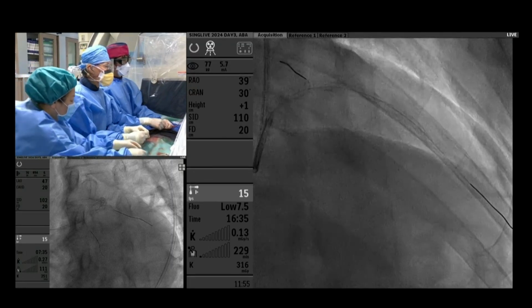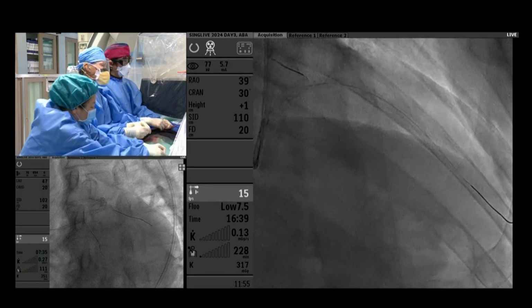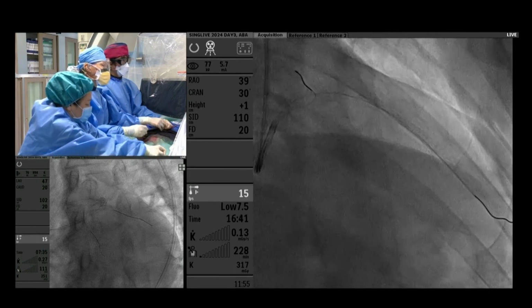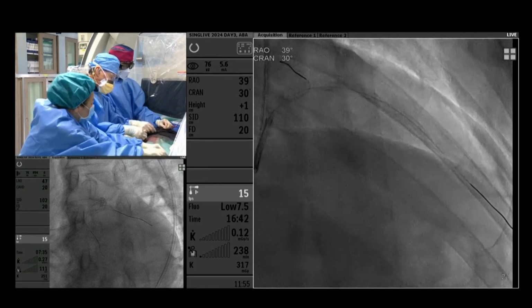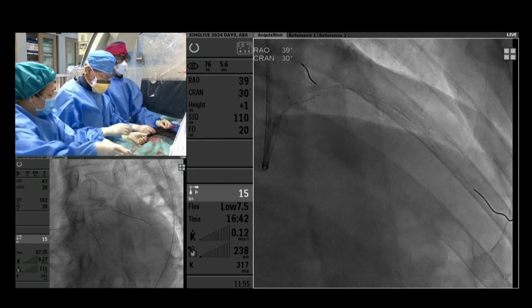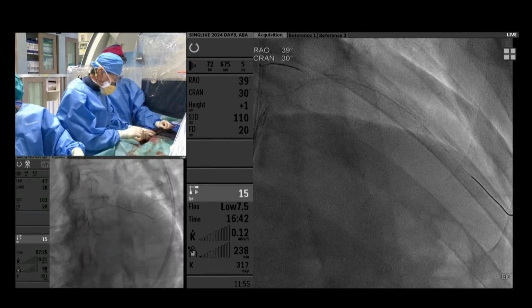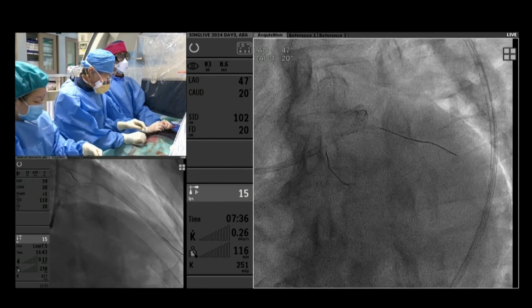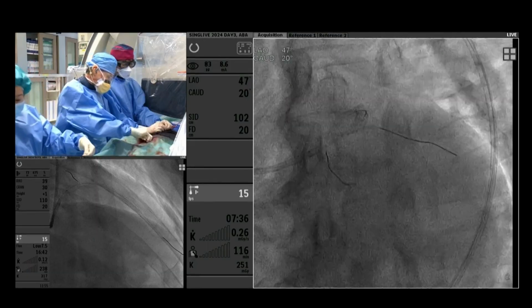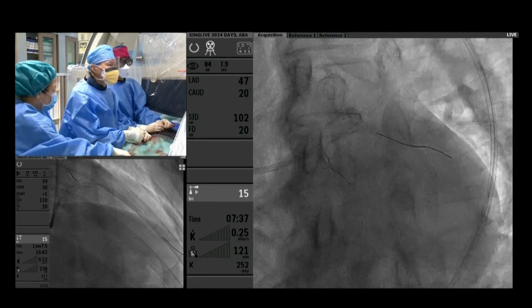So the advantage of this one is that it's a monorail, right? So we can bring the catheter all the way in without a problem. Okay, enough. I'm going to take this one. This is the Thrombuster 2, is it, Prof? I've not been doing calls for live for primary PCI, so I'm not sure of the name.